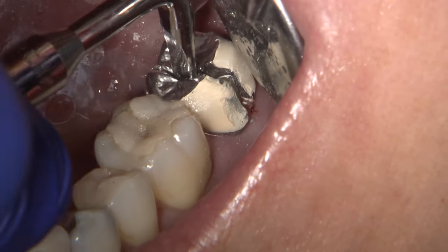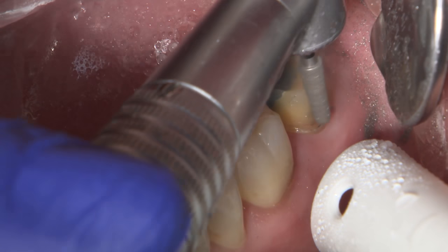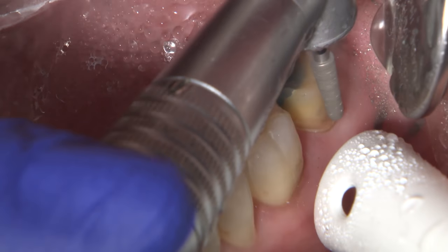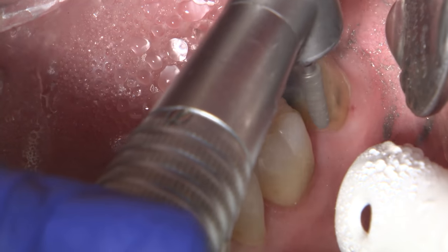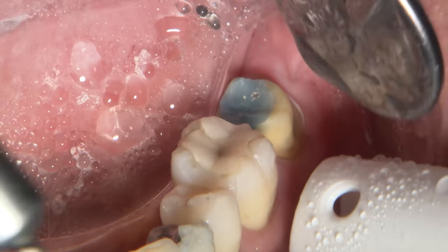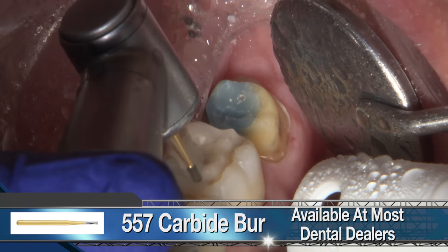So it is quite possible that the previous dentist chose to restore number 18 with a metal occlusal in order to withstand heavy bite forces and prevent the porcelain from chipping or fracturing off. Oftentimes in situations like this, when the third molar is not present to balance out the occlusal force, the second molar gets the heavy load and frequently a fully covered porcelain PFM will fracture. An example of that was number 31 on the other side.